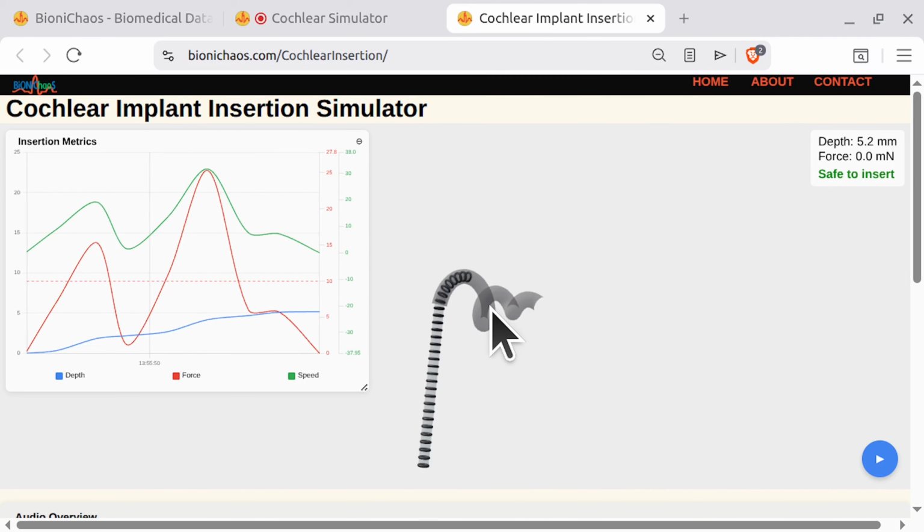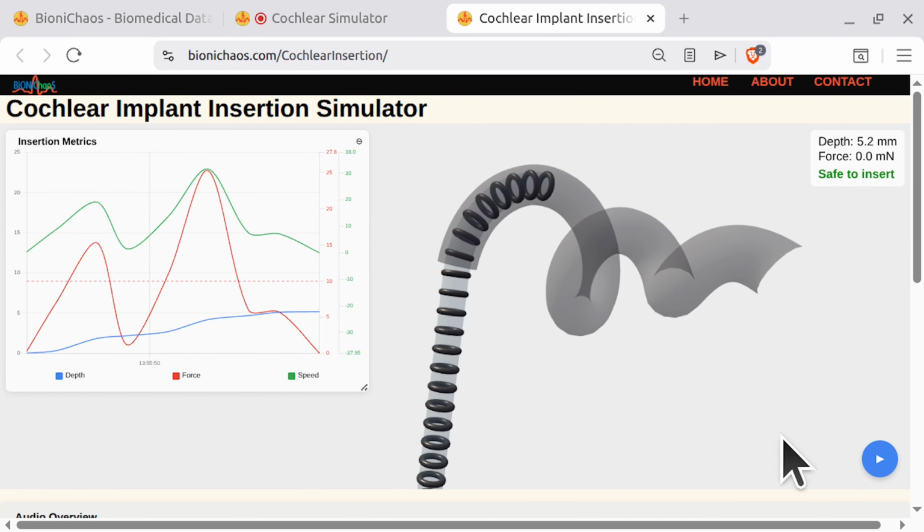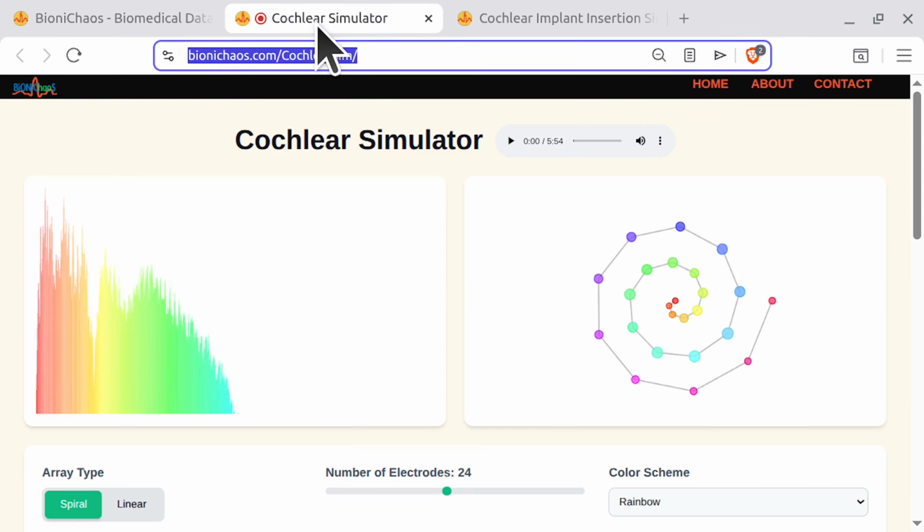Right, but... And that's to say nothing of the adjacent facial nerve. If the implant's electrical signals misfire, they can jump to the facial nerve, causing involuntary facial twitching. So you go in for hearing loss and you wake up with a burning tongue and a twitching eye.